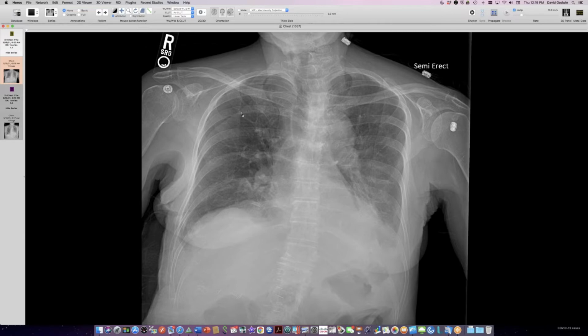Not only that, but there's a Mach band associated with a skin fold that is not associated with pneumothorax. Outside the white part here, there's about 1 millimeter of extra blackness hugging the white edge. So the presence of a Mach band, which is an artifact, it's not real, is another indication of skin fold versus pneumothorax. It's really handy to have them side by side here, in the same patient at the same time.